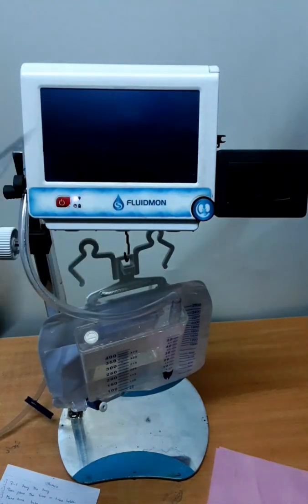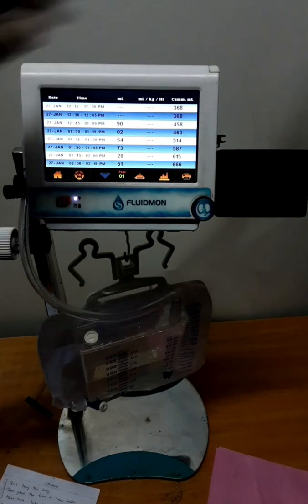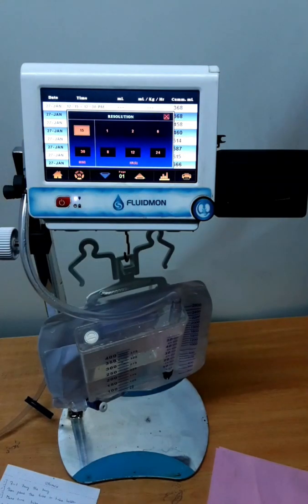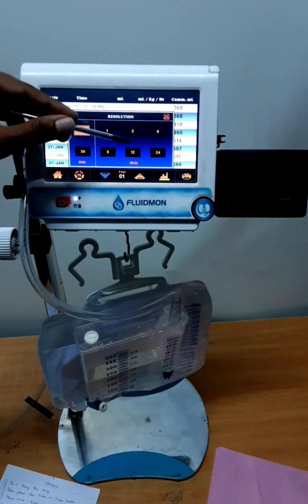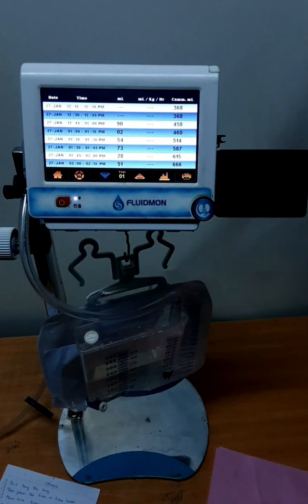This is the trend option. In the main trend option, we have date, time, ml, ml per kg per hour, and cumulative readings. Depending on the selected time, the ml will be stored and the cumulative reading will be taken. We can change the resolution — options include 15 minutes, 30 minutes, 1 hour, 2 hour, 6 hour, 8 hour, 12 hour, and 24 hour. Depending on the resolution, the ml will be stored, as we have seen in the mini trend.